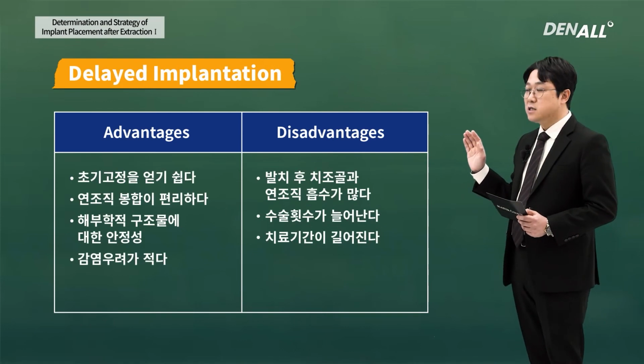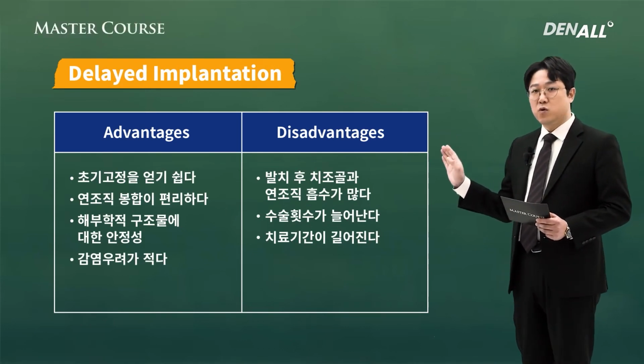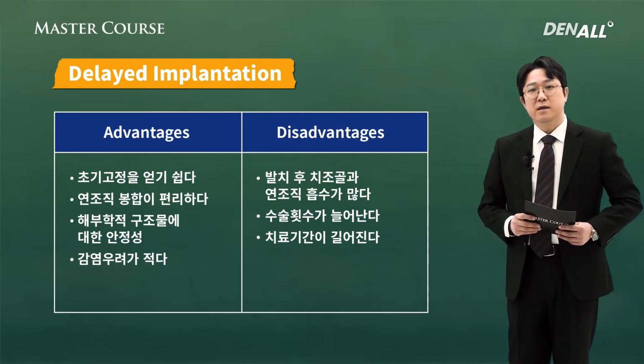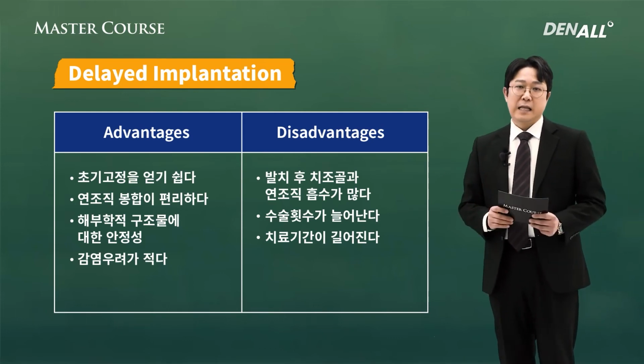In the case where you wait for healing, you can get nice initial stability and get suture very well. And from the surgeon's perspective, there are many advantages, but from the patient's perspective, the treatment period becomes longer.